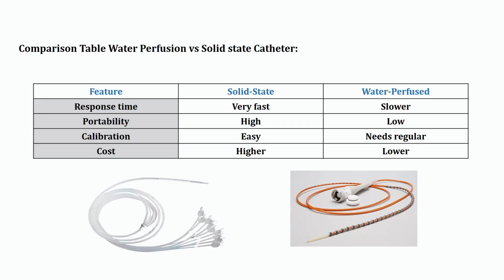Yes, that's totally right, what you mentioned. This is the summary of the difference between the solid state and water perfusion.